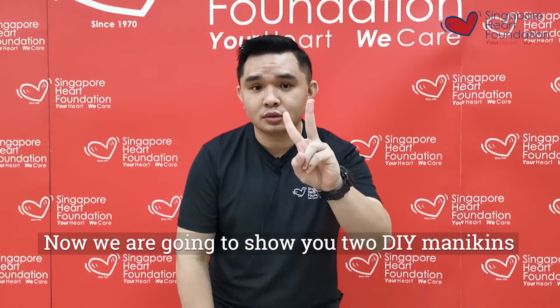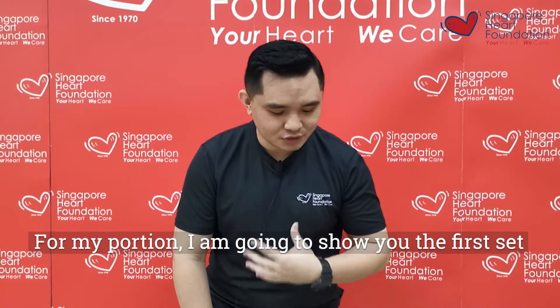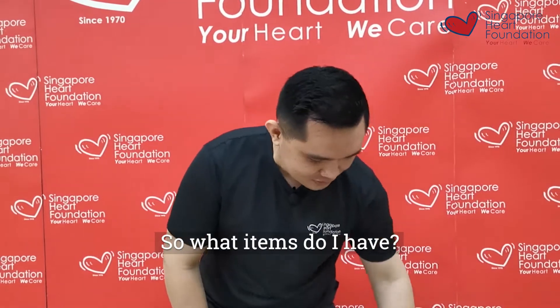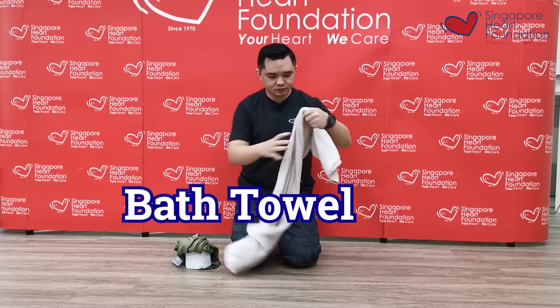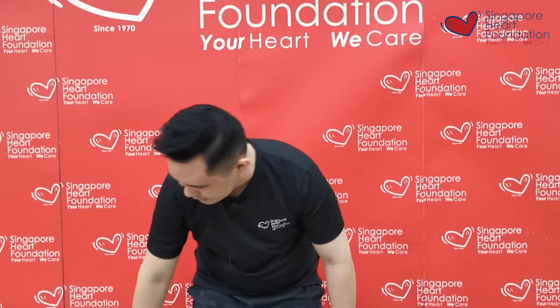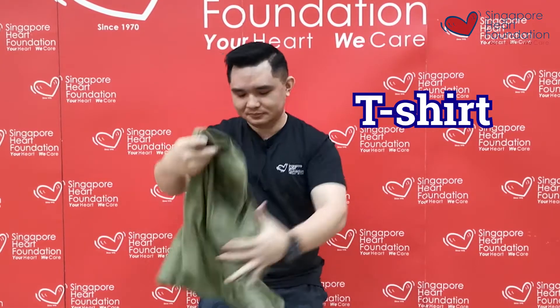Now we're going to show you two DIY mannequins using household items. For my portion, I'm going to show you the first set. The items you need are: first, a towel; second, a T-shirt; and third, a toilet roll.